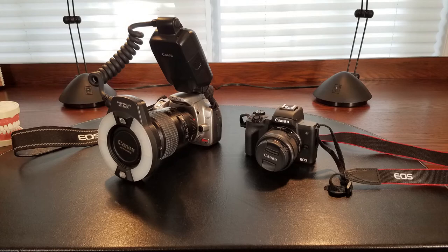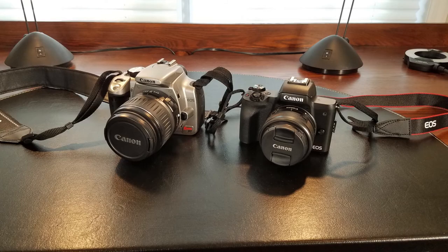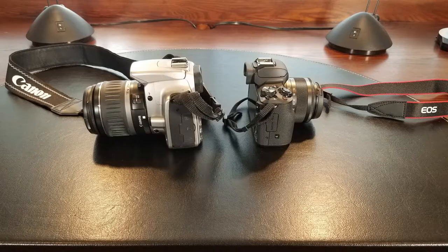Here's a photo of my Rebel XT macro setup next to my M50 with the kit lens. Here's another photo of the Rebel XT with its kit lens next to the M50.